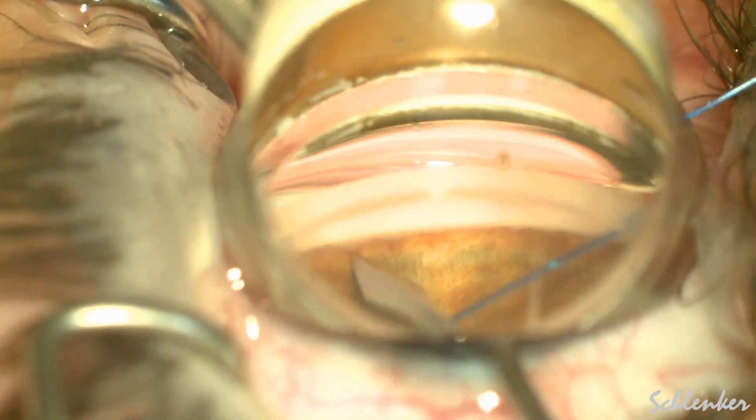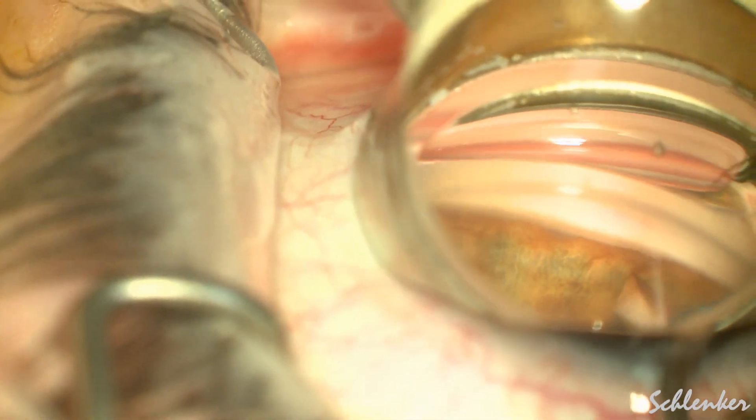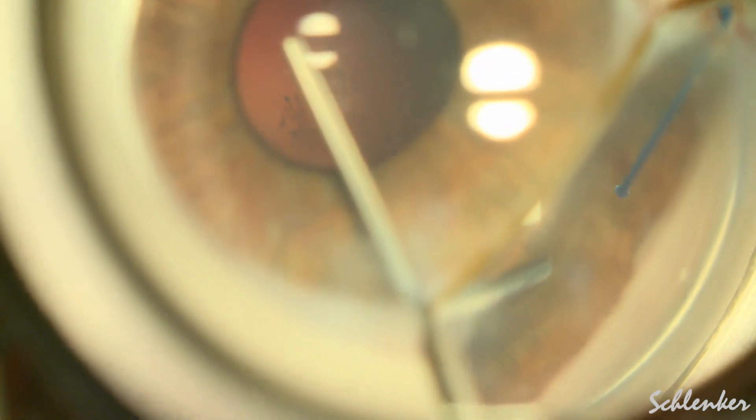This is just using a Swan Jacob lens, looking at the nasal angle, and you can see just using an MVR blade how easily her peripheral anterior synechiae came down, despite me seeing these peripheral anterior synechiae some 6 months ago — and this is not always the case.